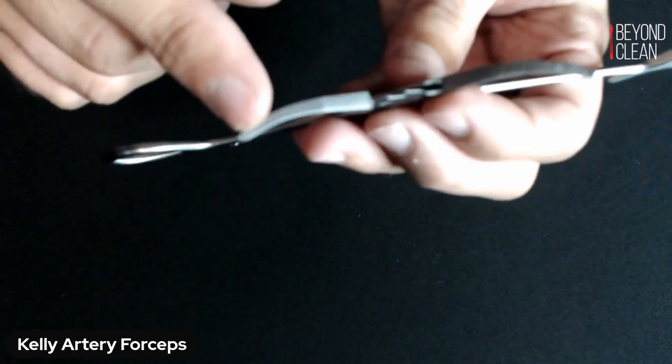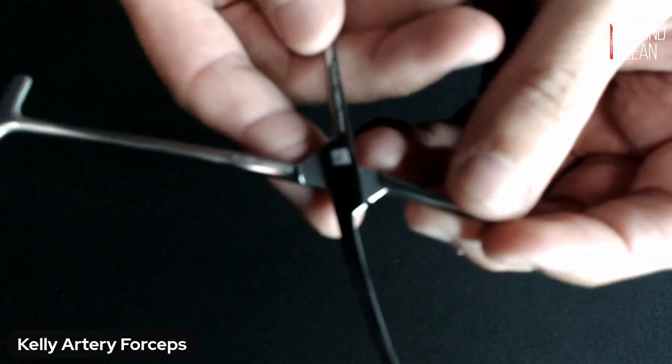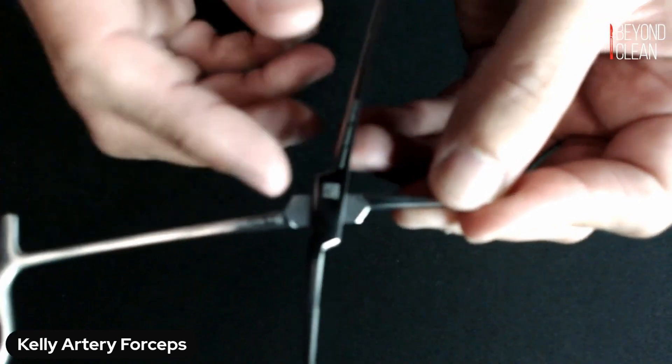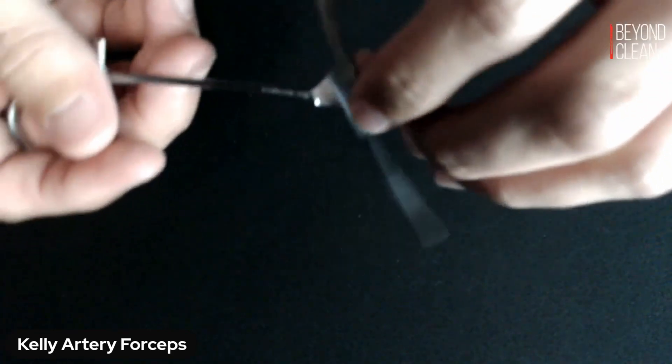Look up and down the jaw inside the box lock area here on both sides, in that hinge area. Open all the way up to full extension. Make sure that you can see all the way even into and underneath that box lock area to check for debris.